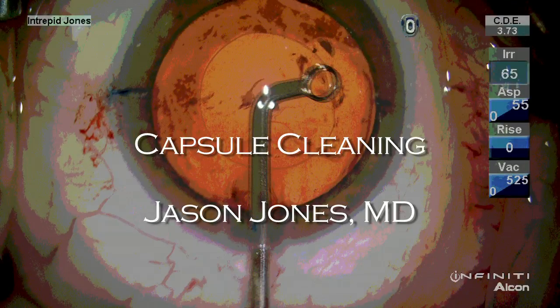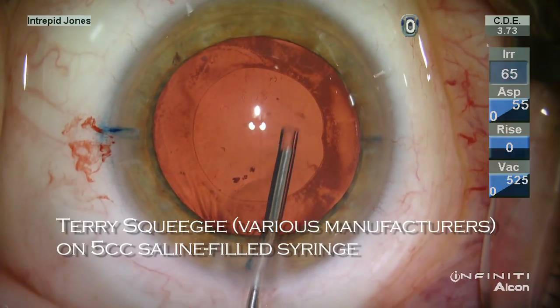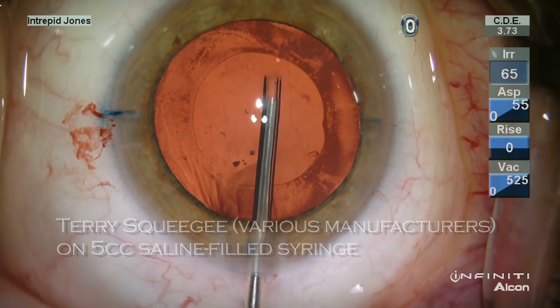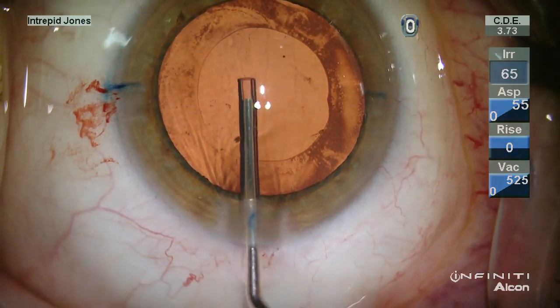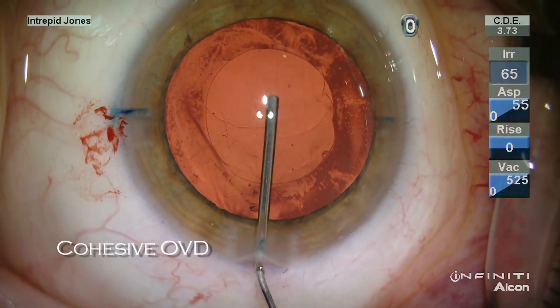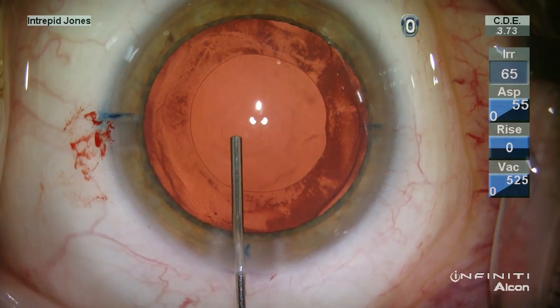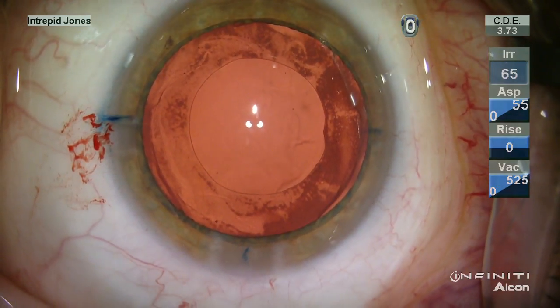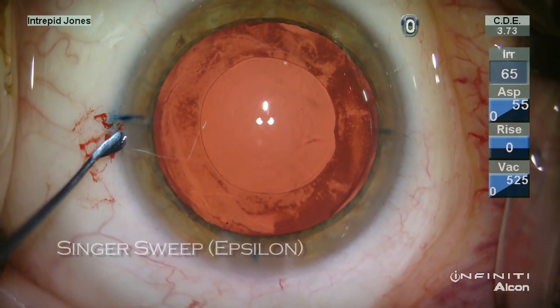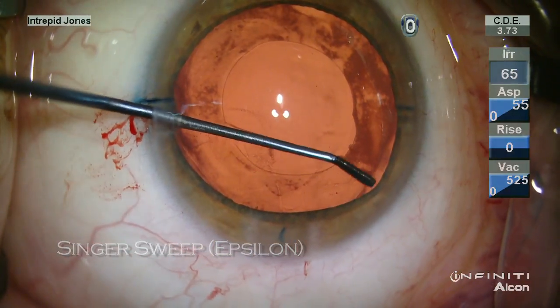I'd like to describe for you during this video my technique of capsule cleaning. I employ a silicone tipped cannula on a BSS filled syringe to remove central material from the posterior capsule, and then under cohesive OVD to inflate the capsule bag, I employ a Singer sweep from Epsilon.